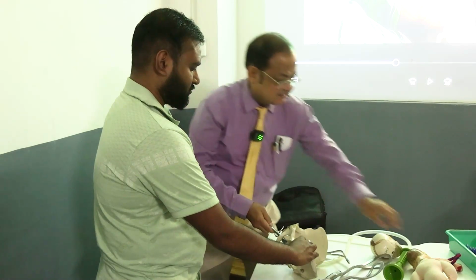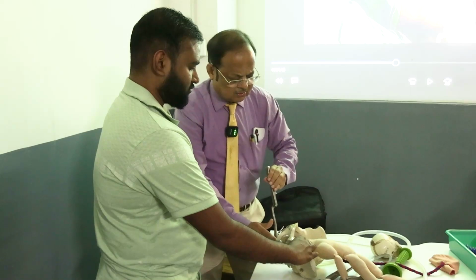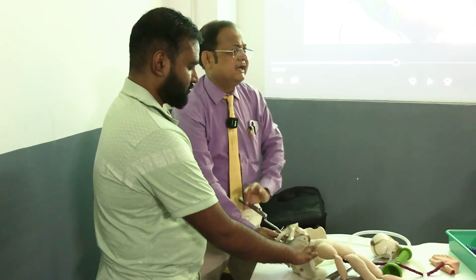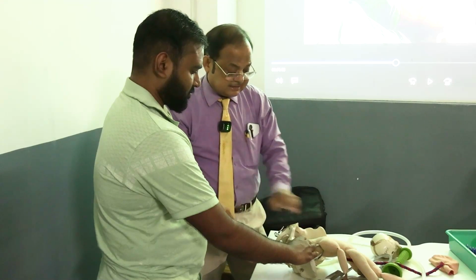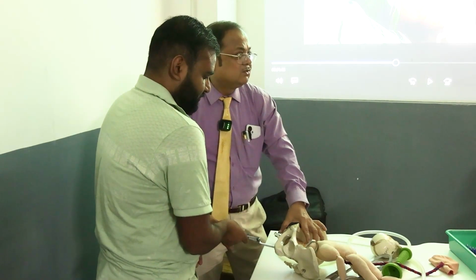If the application is correct, it will go by the pressure of the thumb, and the other hand will just guide. That is the basic principle, and you will know it from the very beginning. And the assistant will hold this. I'll ask the assistant to hold this.